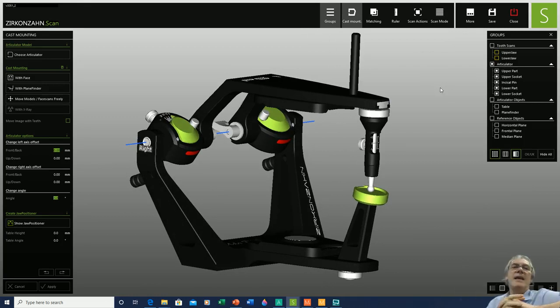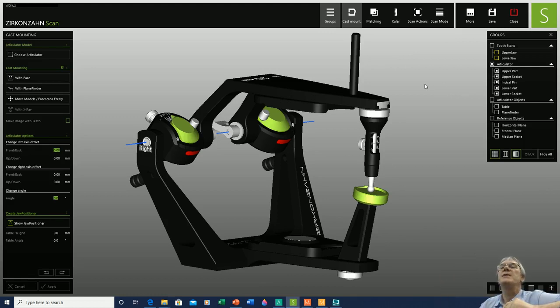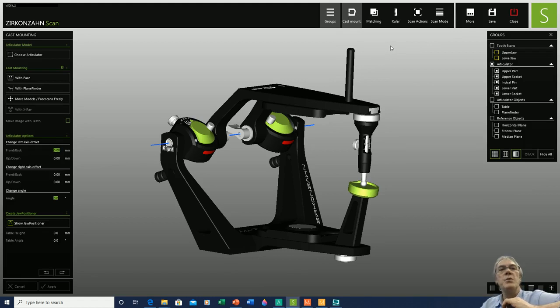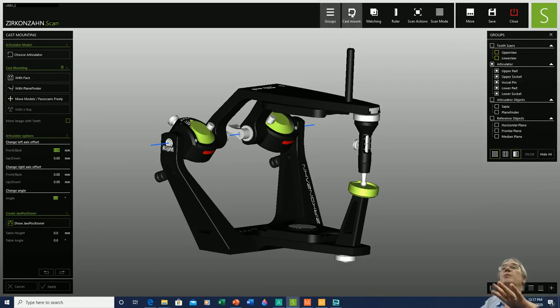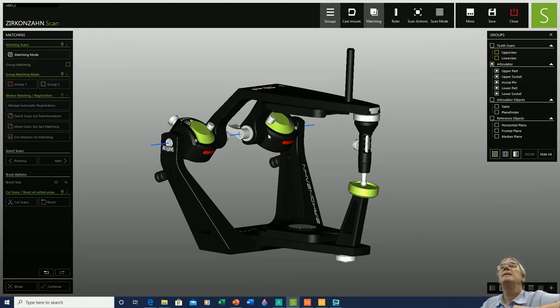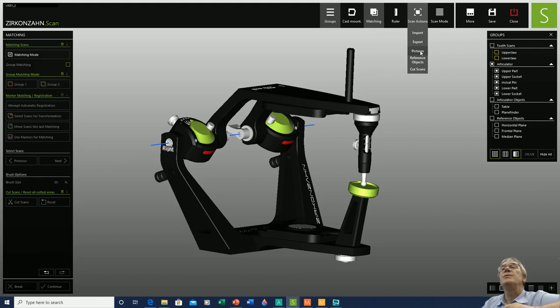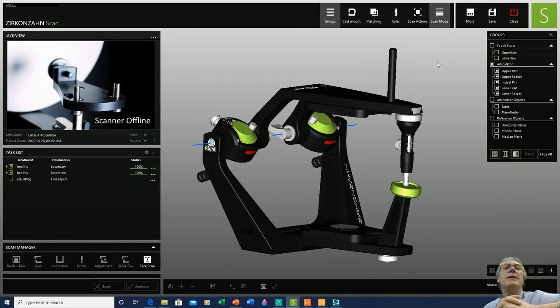This process has been performed for many years in the analog world with its difficulties, and bringing it into the digital world makes it easier and quicker. At the top we have the window relating to groups, the cast mount window we'll be using today, and anything that needs to be matched can be performed there. Files can be imported or exported, 2D pictures can be added to the workflow, and scans can be trimmed.